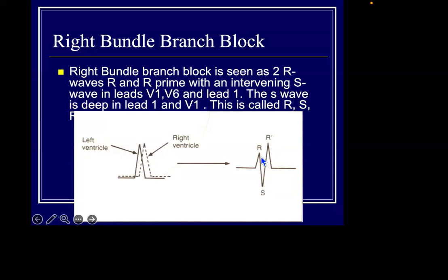And the next R wave is the R wave of the right ventricle activity, because we have right bundle branch block, so the right bundle will be delayed. What will come first is the activity of the left ventricle. That is to say the R wave is split. First portion is due to left ventricular activity. And the last portion is due to right ventricular activity.